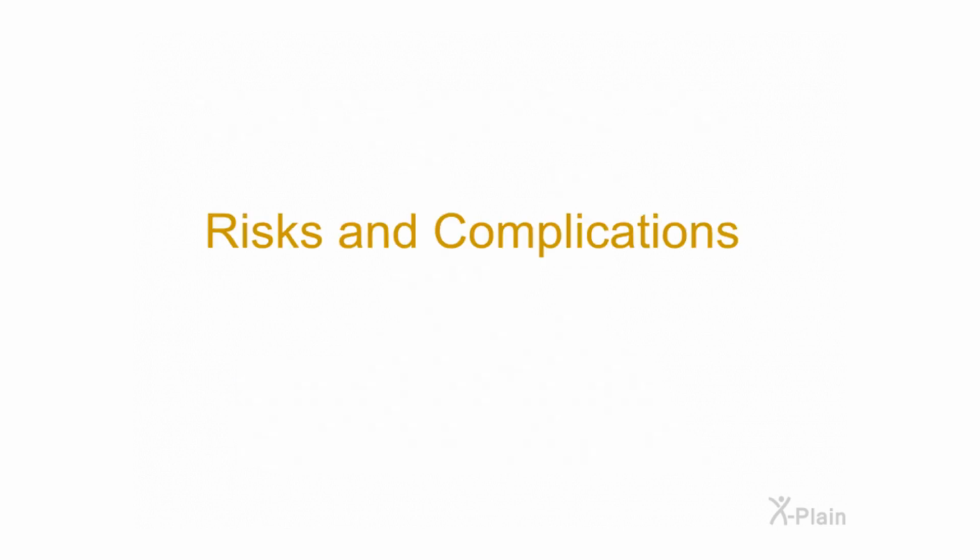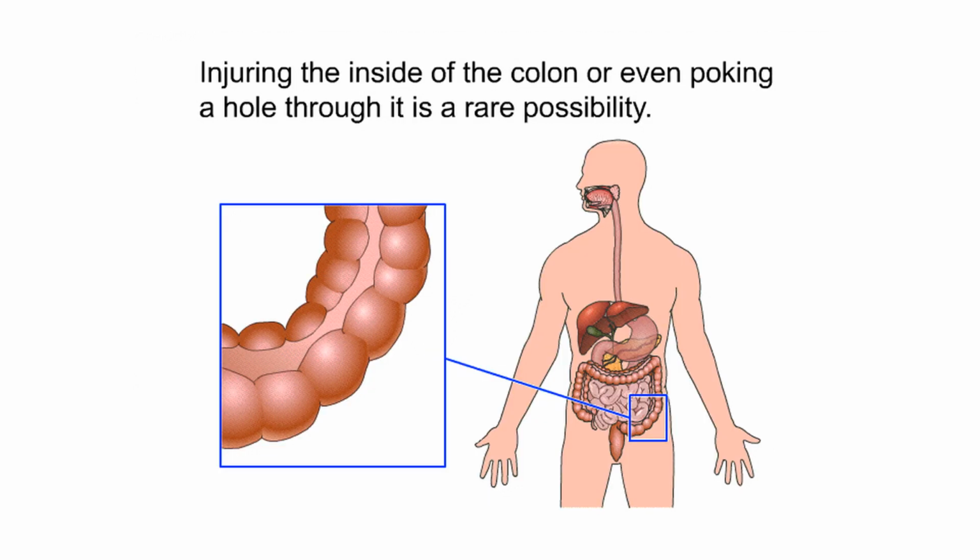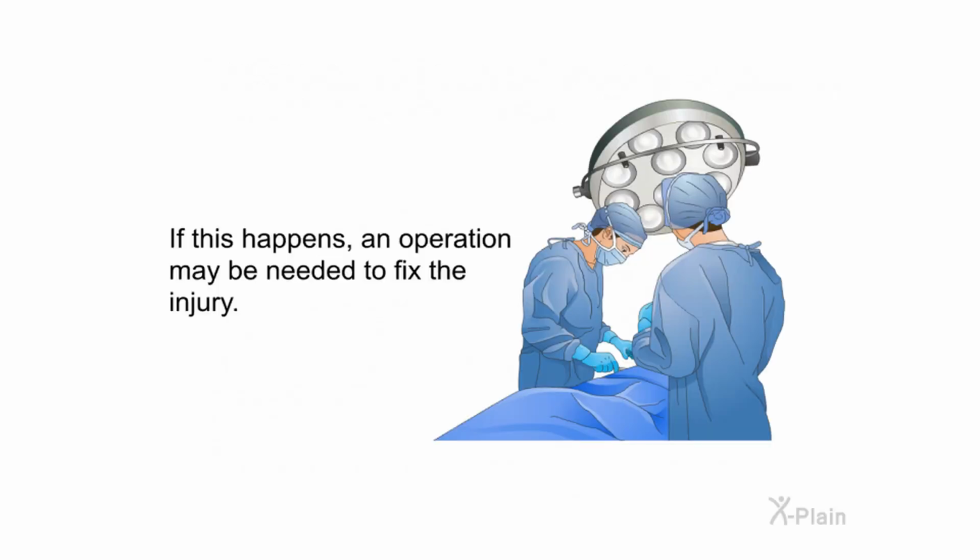Risks and complications. A colonoscopy is a very safe procedure that could be life-saving. However, it has possible risks that you should learn about. Injuring the inside of the colon or even poking a hole through it is a rare possibility. If this happens, an operation may be needed to fix the injury.